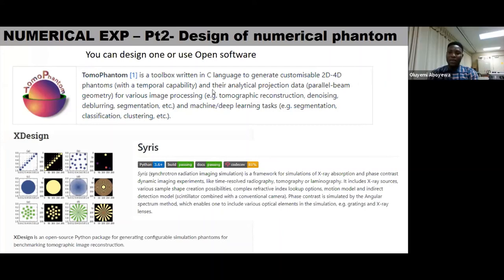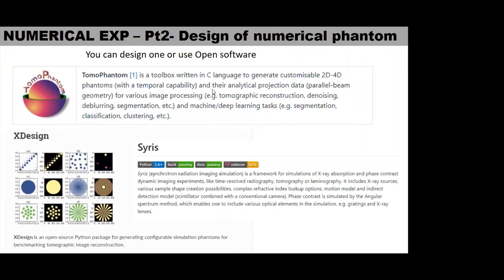Yes, perfectly. I think that's one of the strengths of dual energy CT. You can easily tell that variation in tumor types, and anything that can help us explore the chemical composition, because that variation will come out from tumor vasculature and every other aspect of it. So it's not just prostate cancer; within the prostate cancer, there are different segments. Some aspects of it are closer to oxygen than others. You have a region of necrosis and other stuff. So using a technique like this would help us identify those regions, because now you can separate everything based on their material composition, know why this one is a bright signal and this one is a little dark, and know how best to treat it. I think it's something worth exploring.